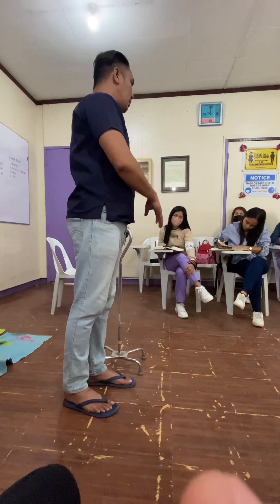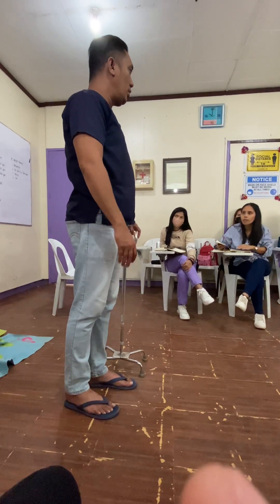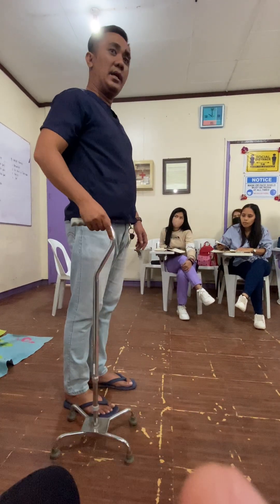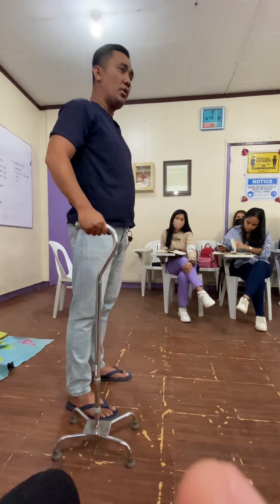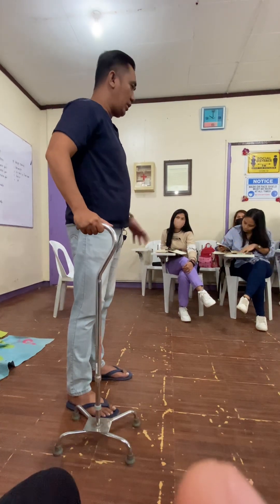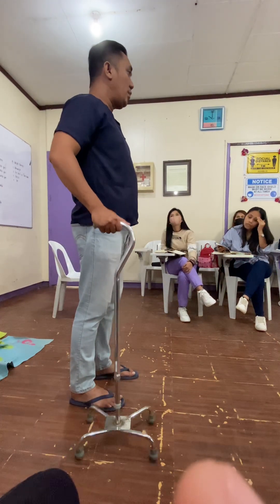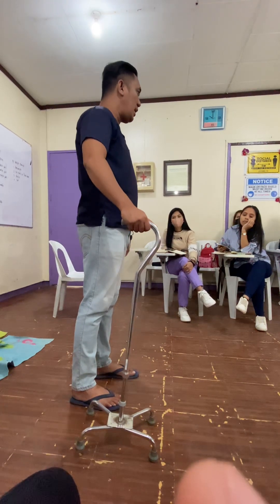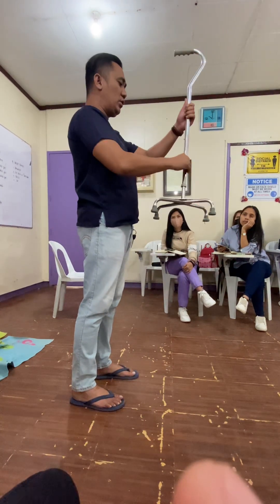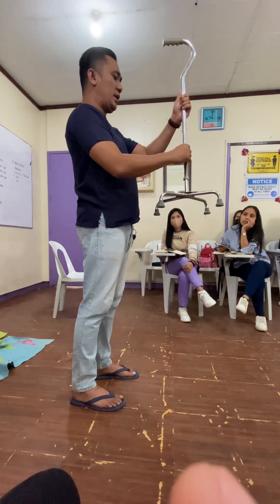But what if the injured leg or the weak leg is on my left side? The cane should be on the right side. Again, the cane should be located on the opposite side of your injured or weak leg. So in this case, all you have to do is switch the sides so that the base tips are facing toward the patient.